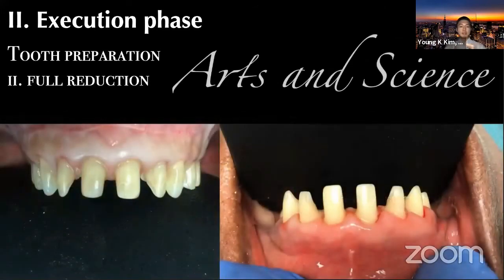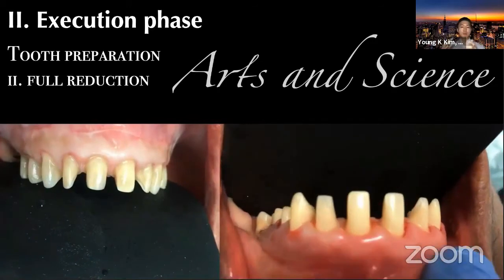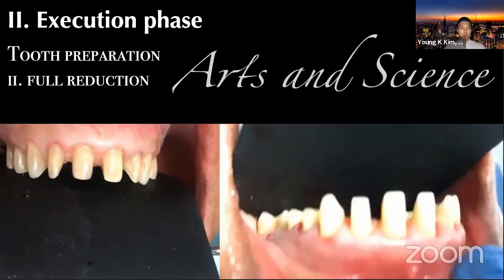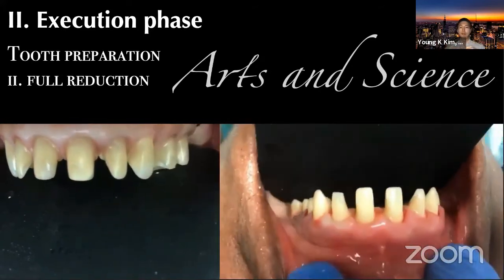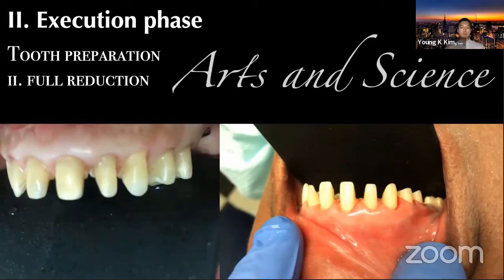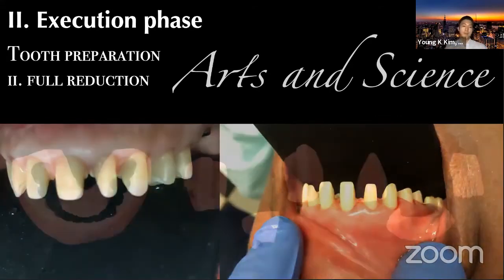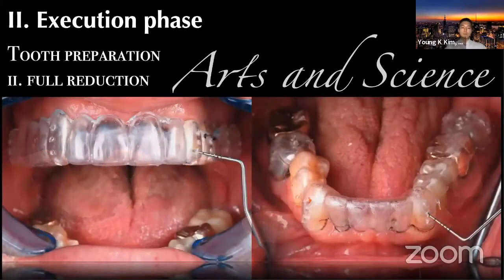And once decided, you follow such algorithmic principles of tooth preparation in arts and science. The biologic, mechanical, and aesthetic rules should serve as the foundational baseline. Architectural engineering concepts, as I said, derive the mathematical ratios, geometric rules, and the principles of tooth preparation. And I personally use several reduction guides, both with the putty and also the vacuum, and you can visualize where you're going.